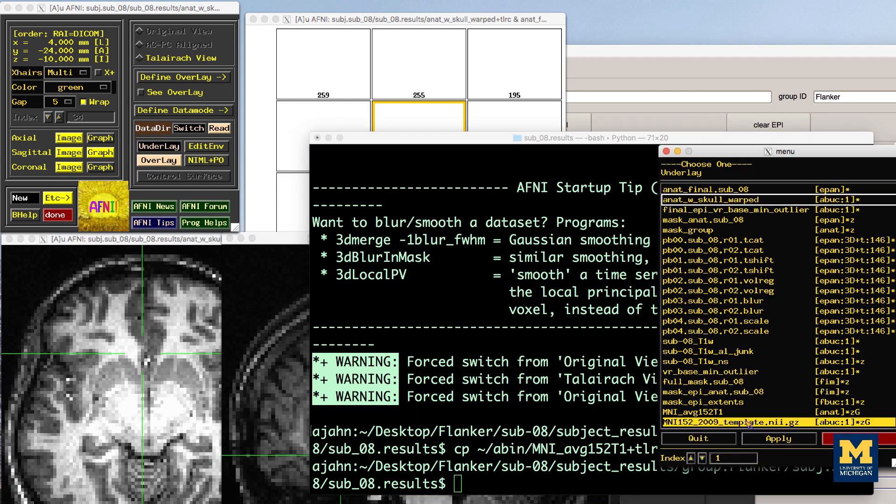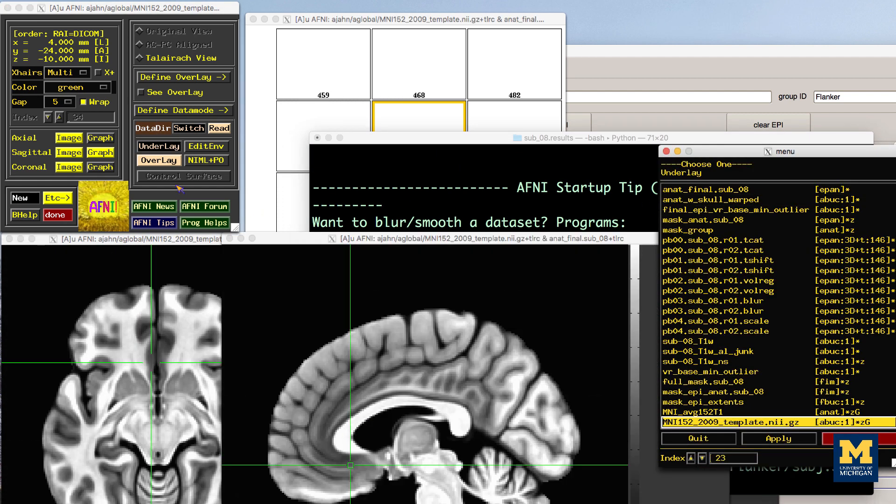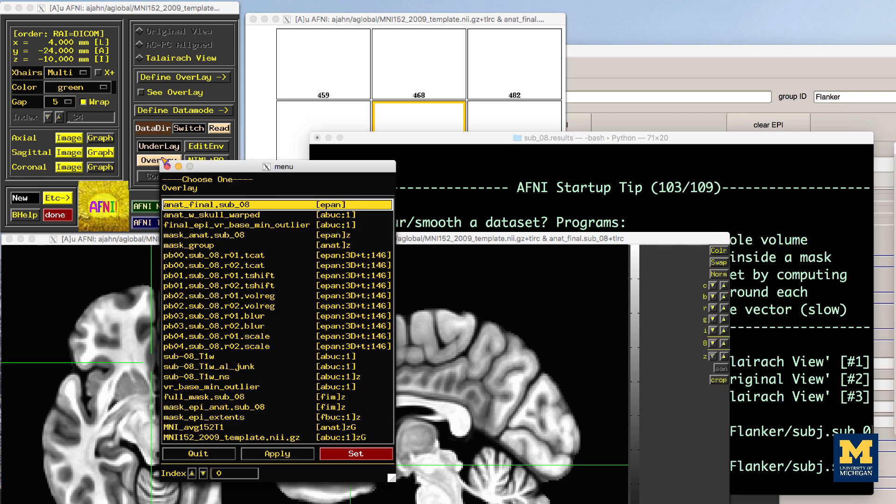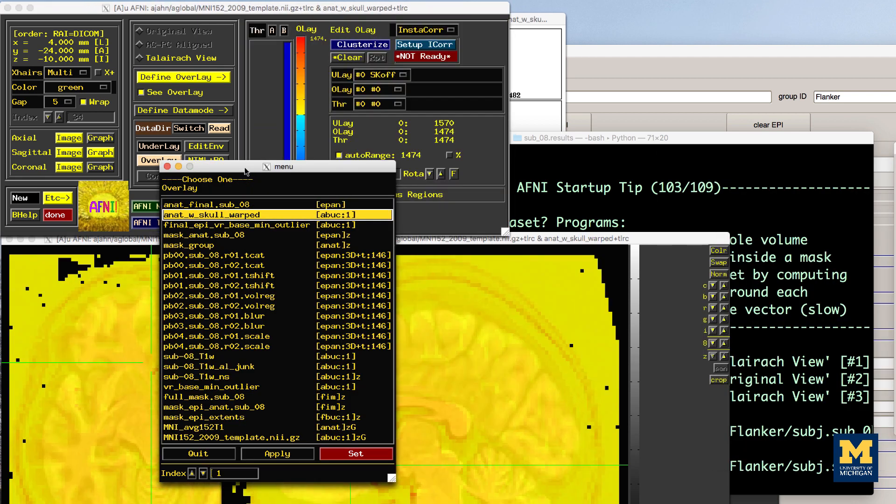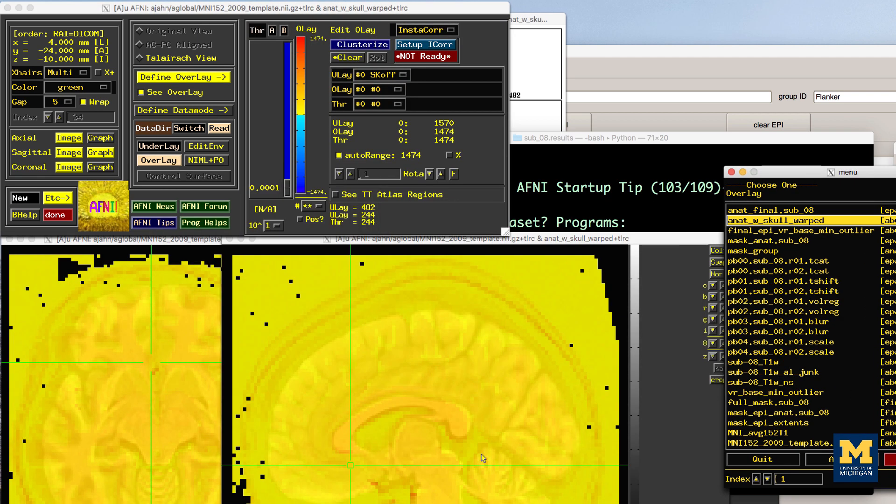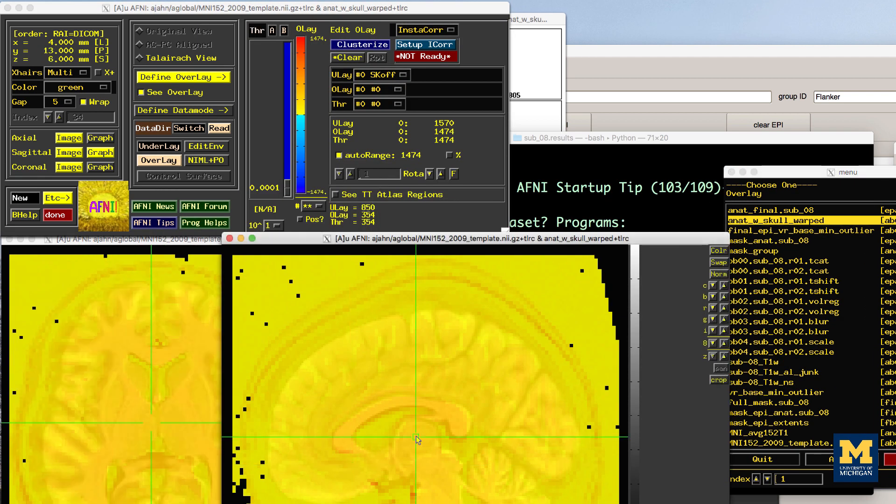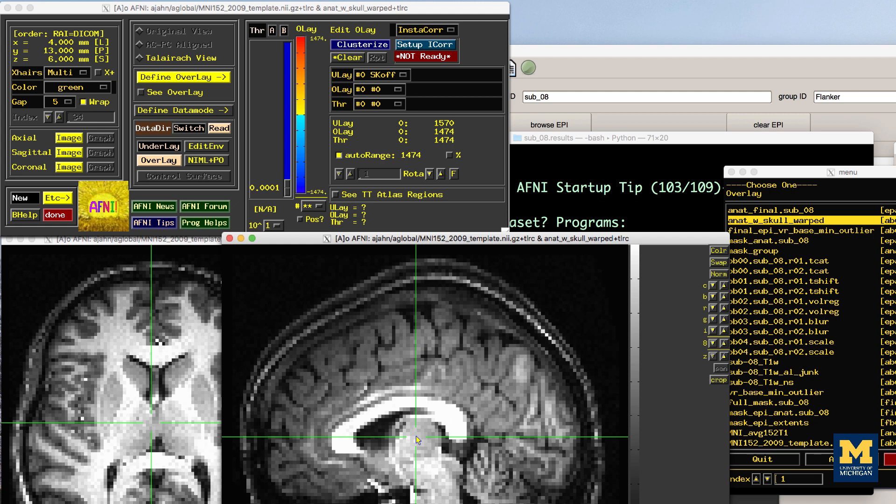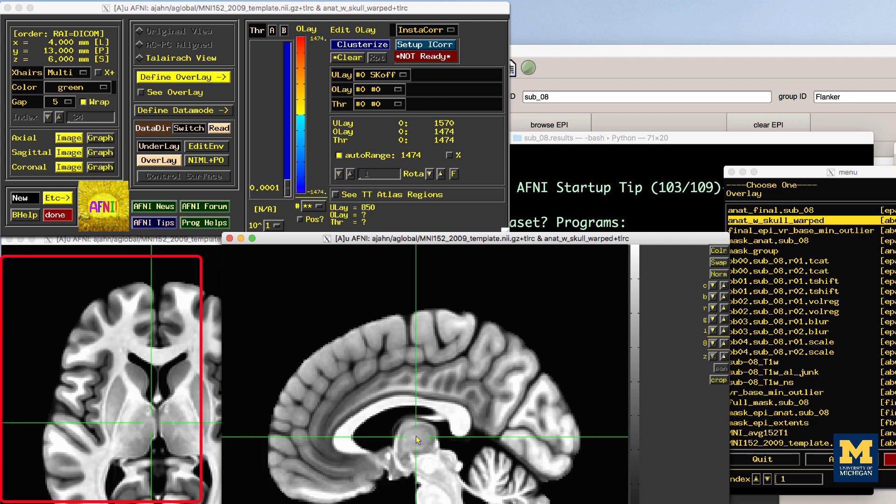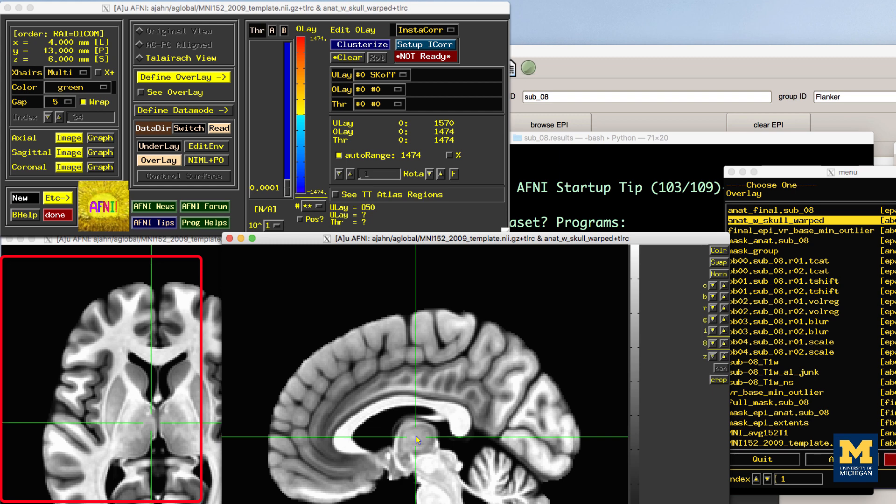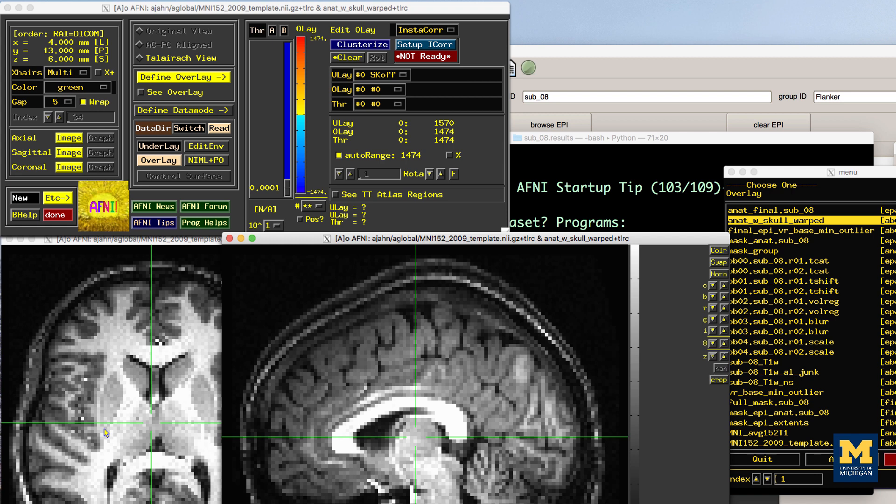You may notice that while the sagittal view of these two images overlaid looks fine, the axial and coronal views look worse. It seems like the image is shifted to the right. Although it is common to have some variability in normalization, this is more than we would expect.